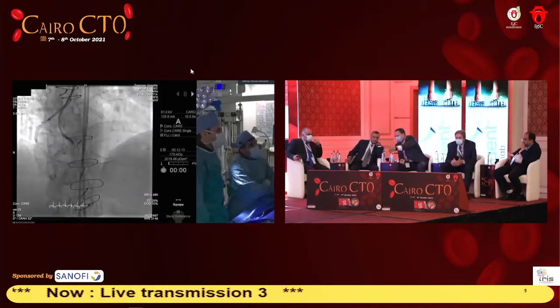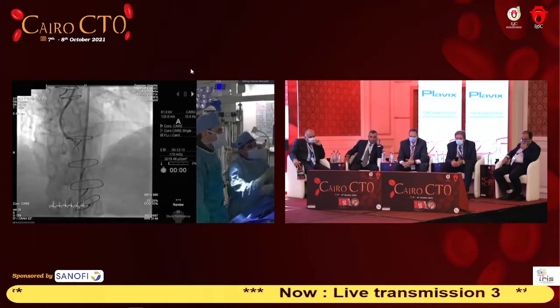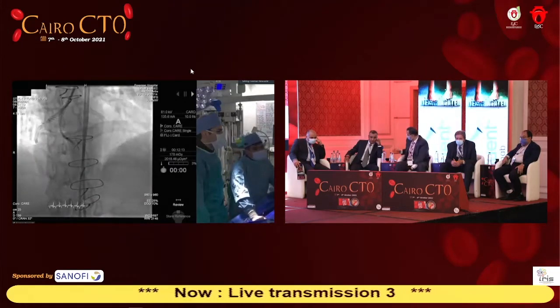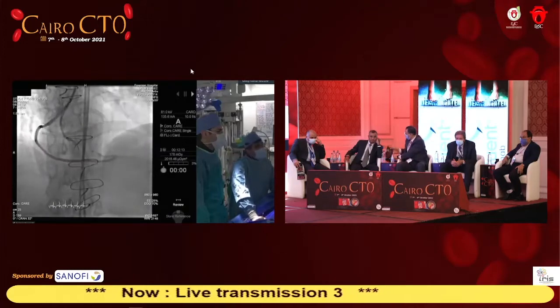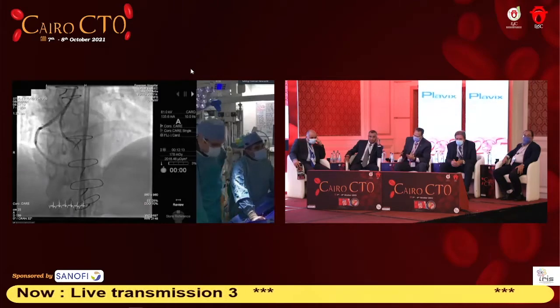It was about being efficient, safe, and quick to avoid delay and to avoid X-ray and dye. In this case, of course, I could try antegradely, but as I said, the proximal cap is quite ambiguous. Despite the occlusion being short, the proximal cap is ambiguous. I could spend a long time trying to go through it, and also I could cause a problem because you're going to need a stiff wire to go through the cap.